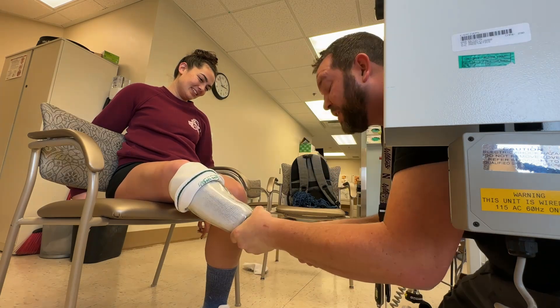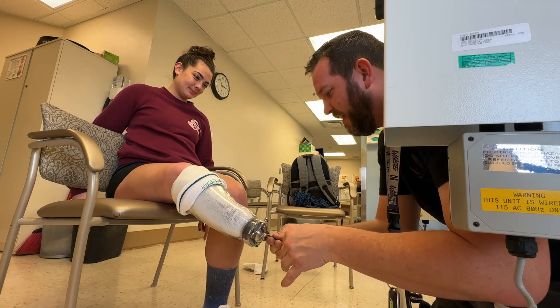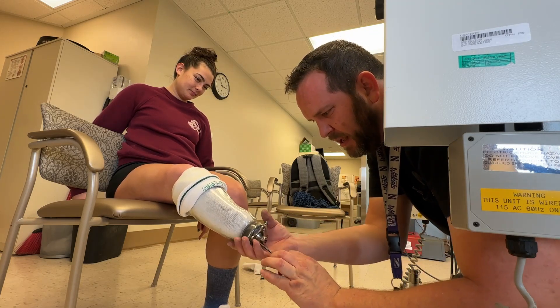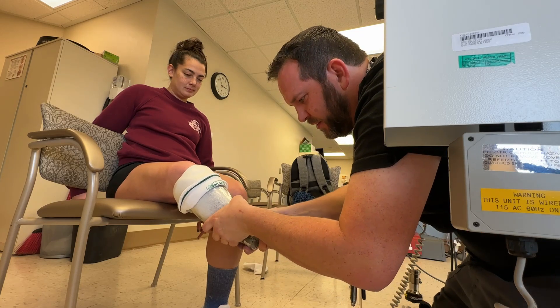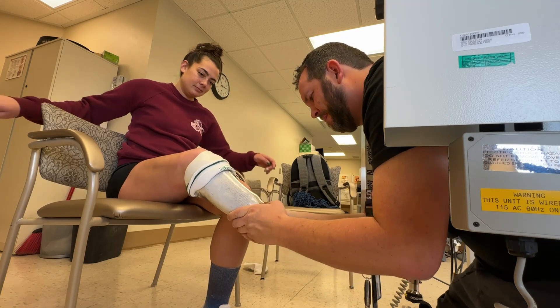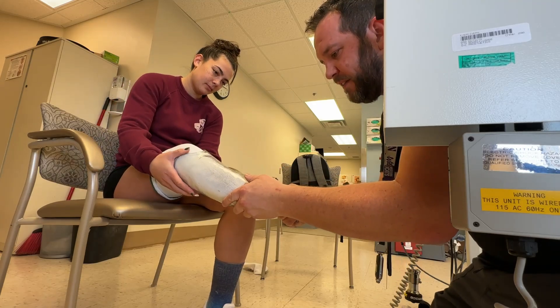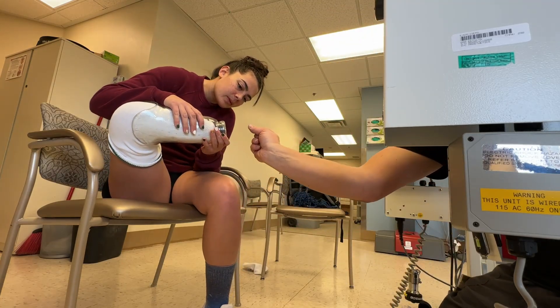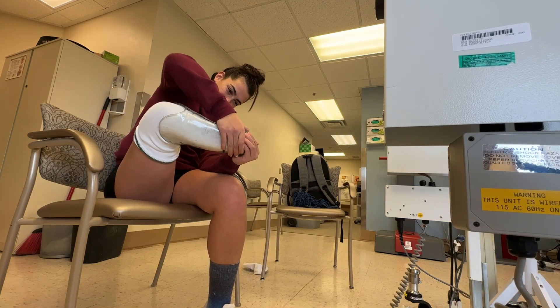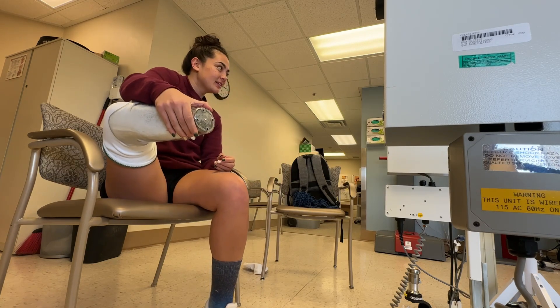This one doesn't make me too fond either. That's why we reinforce it. It's usually just fine in here, and then we reinforce it before you go, because this is exactly what can happen. If I'm hurting, you holler, okay? That didn't work. Probably have to go get the hammer to give it a little bit of attack. It's kind of jammed — it's wedged now because there's that funky angle, so it's jamming up the device. Let me grab a couple things. We'll have you out of that in a second.